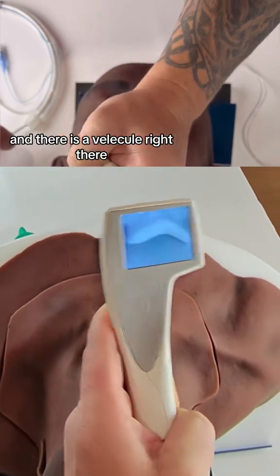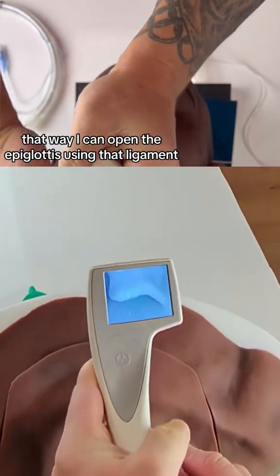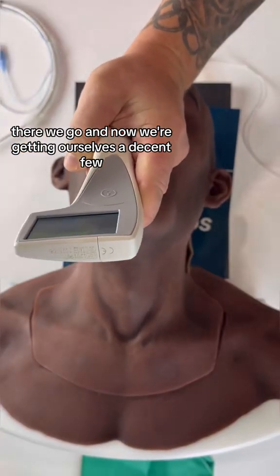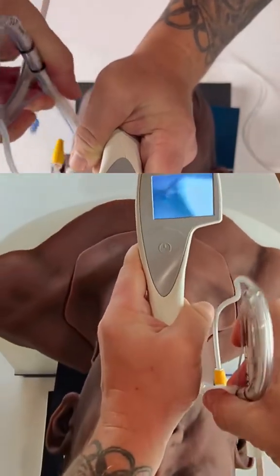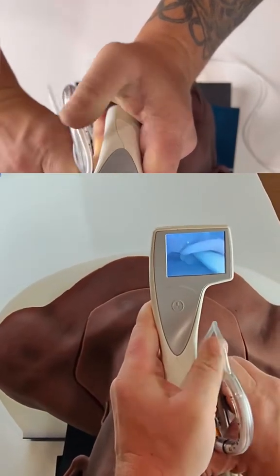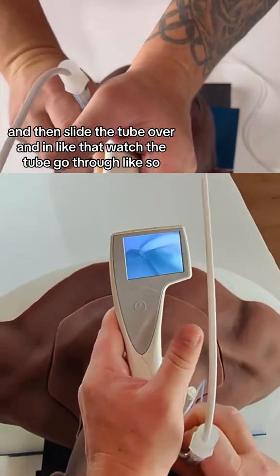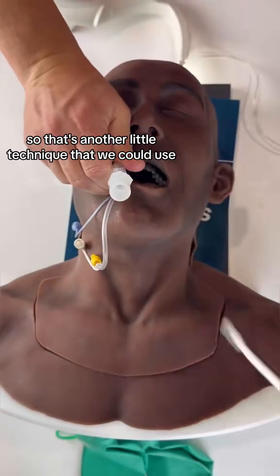Now I'm getting a good idea of where the vallecula is — there it is right there. Once I'm seated in the vallecula, I can open the epiglottis using that ligament. There we go — now we're getting a decent view. From here I take my bougie, insert it, then slide the tube over and in, and watch the tube go through.